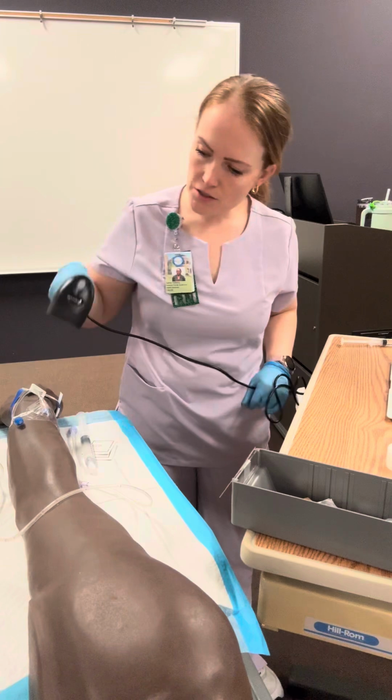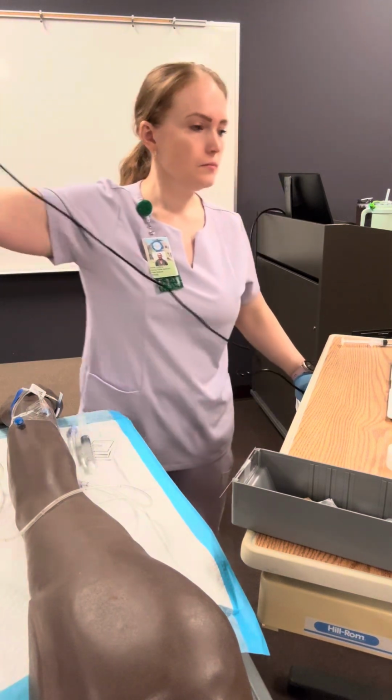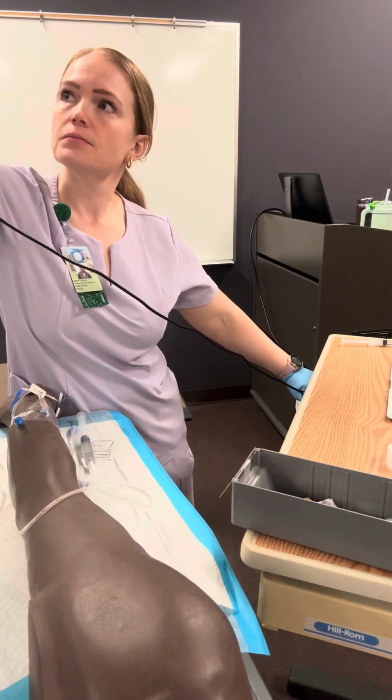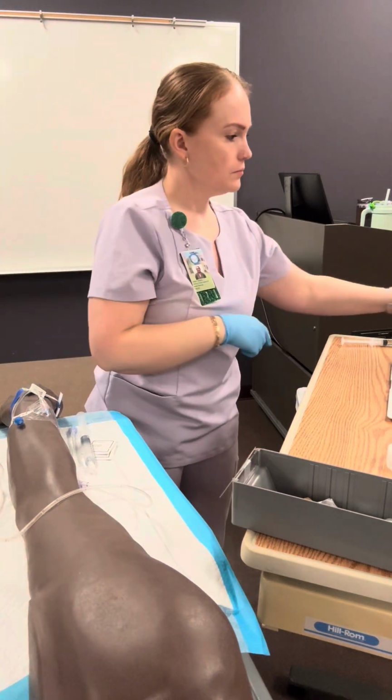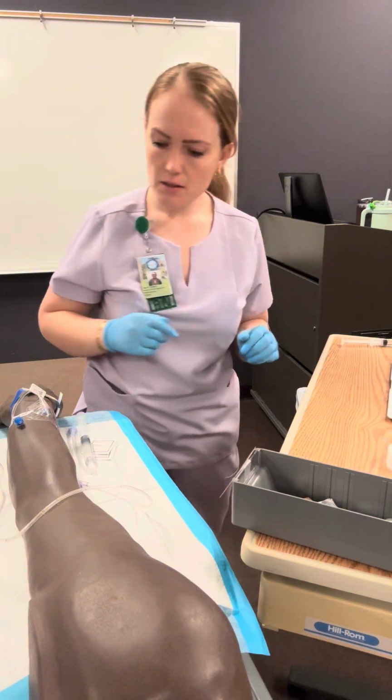And then scan the patient's wristband. Scan the medication. And it's pulled up on my side.